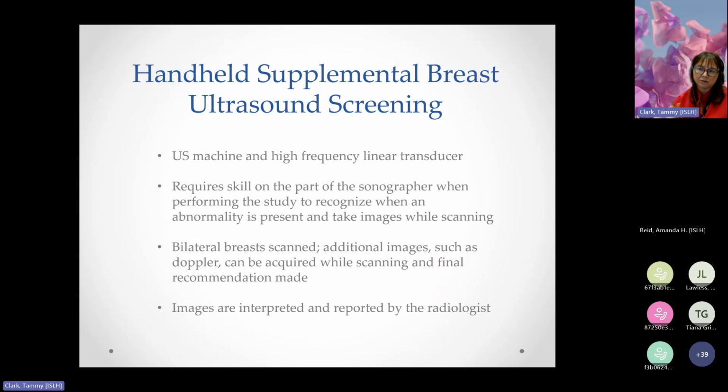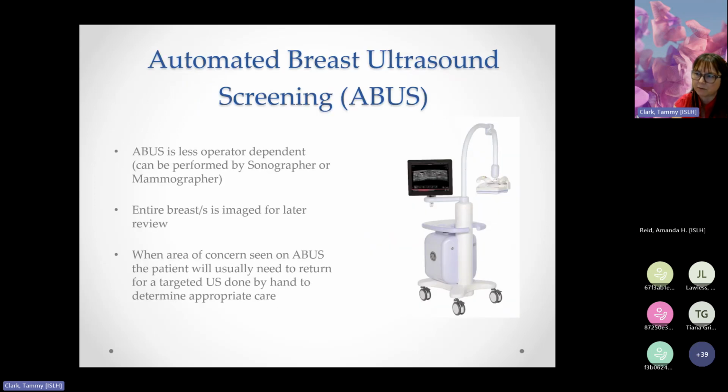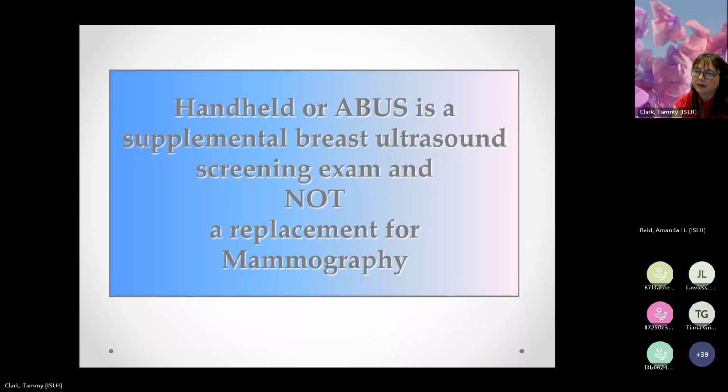Some breasts, when you're doing the handheld, there's nothing in them except for density, but you're having to scan through to see if there's anything there. Some breasts, even the very small ones, pack a punch. There can be lots of stuff in there. So those ones may take longer to scan and of course write up. We want to make sure everyone has the appropriate time to perform these exams.